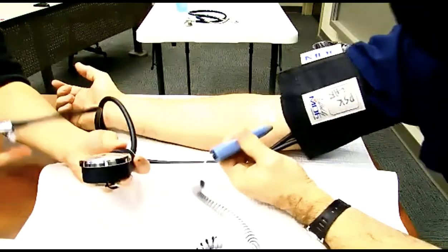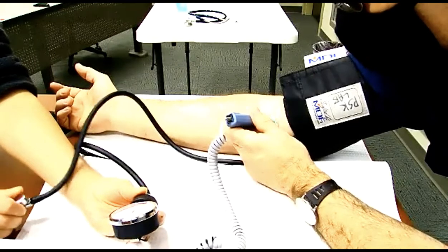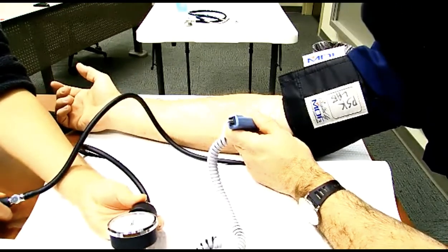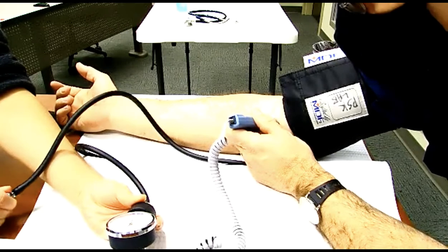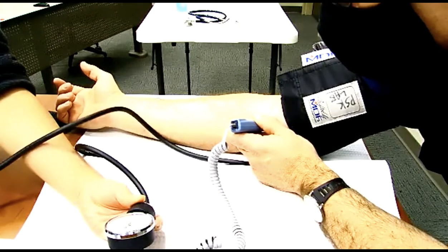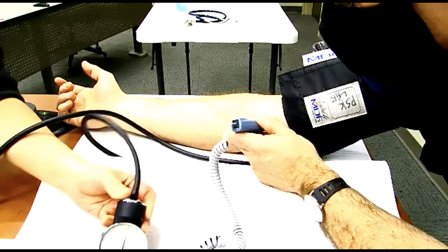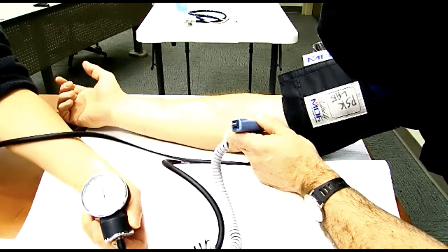So the advantage to this ultrasound is that, hopefully everyone can hear that. What you're hearing is the blood flow, the pulse going through my arm. So now Judy is going to start to pump the cuff. See if you can point the pressure gauge the other way so they can see. So she's pumping, but the blood is still flowing.